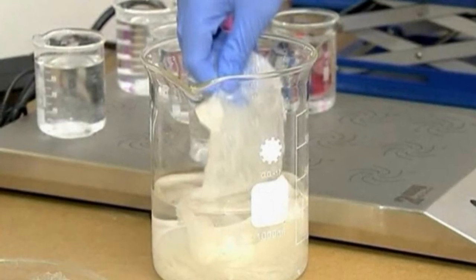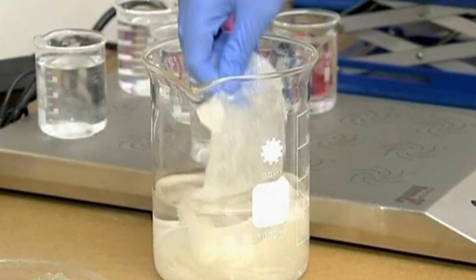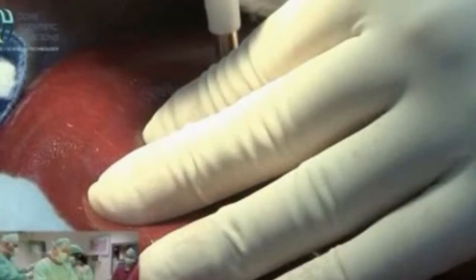He says that this is why wound clot was chemically crafted to stop bleeding, enhancing the natural clotting process while maintaining its own stability for 24 hours.